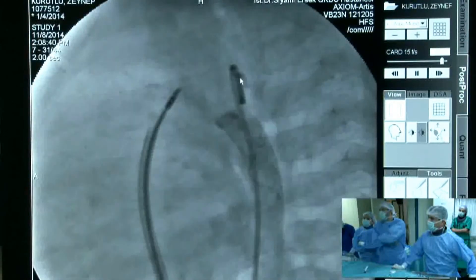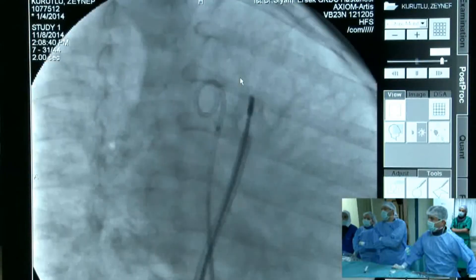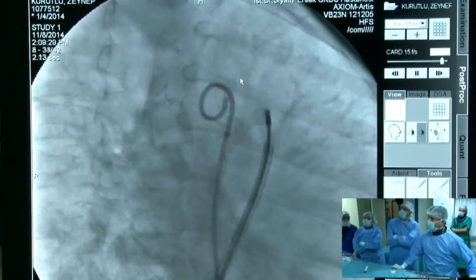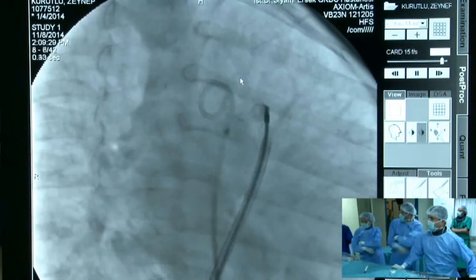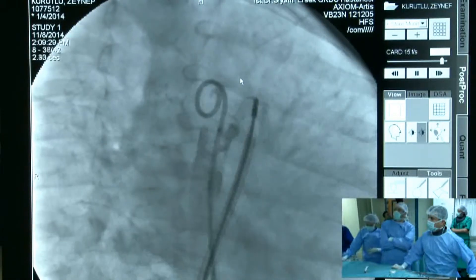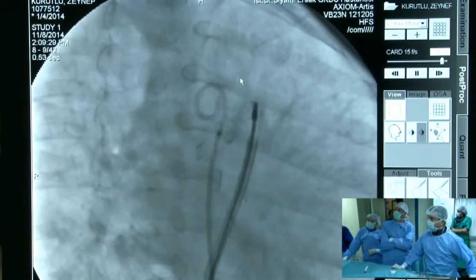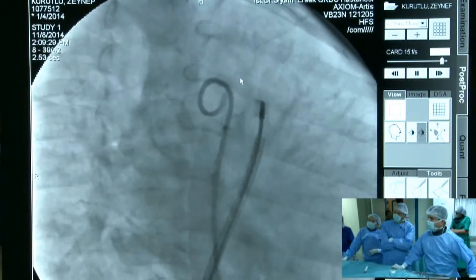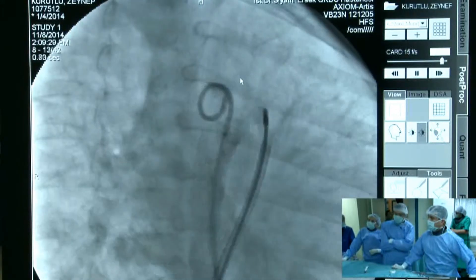That is exactly the concern — you cannot really judge whether there is protrusion into the lumen of the aorta from this projection. A better RAO angle is needed to answer that question.